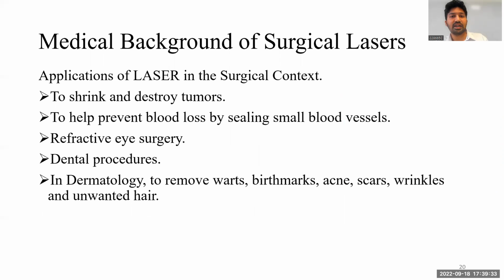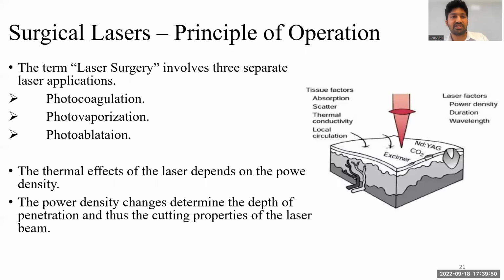Basically, the application of laser in the surgical context can be summarized as shrinking and destroying tumors, preventing blood loss by sealing small blood vessels, refractive eye surgery, which we call LASIK eye surgery, and dental procedures, and also in dermatology to remove warts, birthmarks, acne, etc. Laser surgery involves three separate applications.